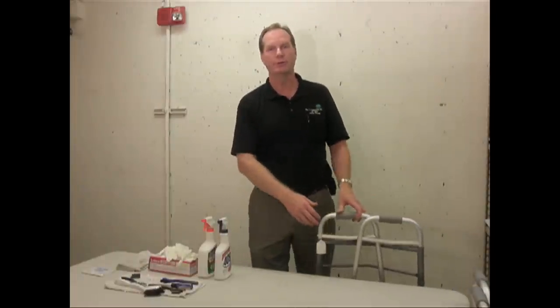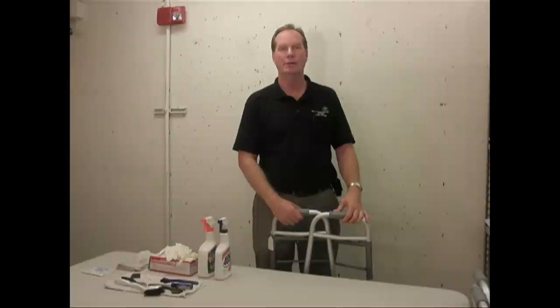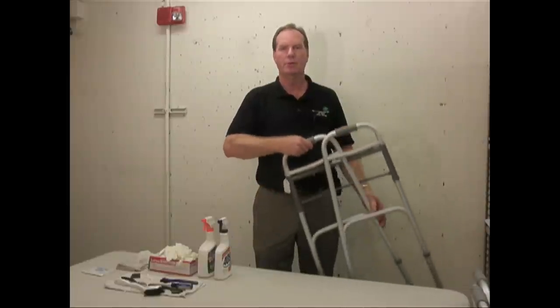I'm Don Harmon. I manage the Equipment Restoration Center at the Neat Center at Oak Hill. Today I'd like to show you how to clean a basic piece of medical equipment — a folding walker.